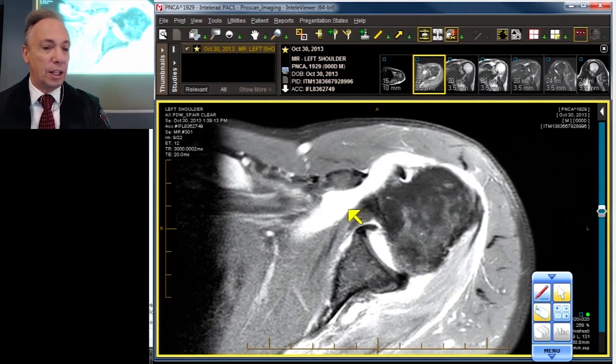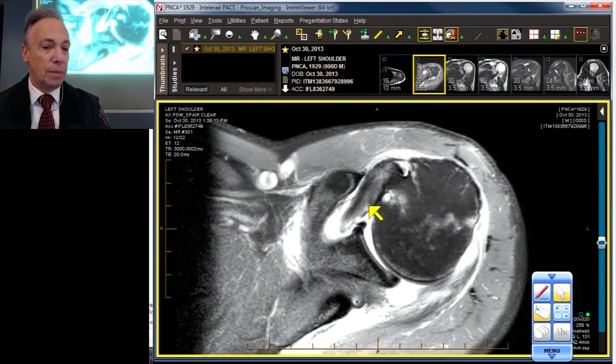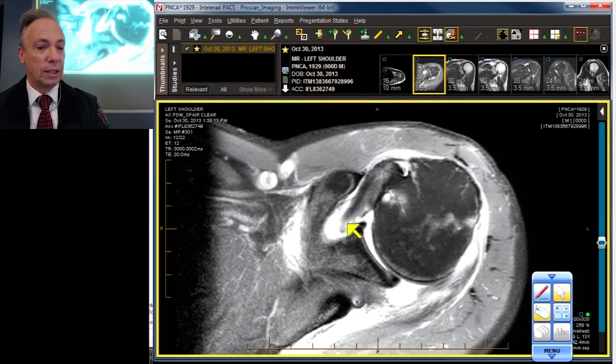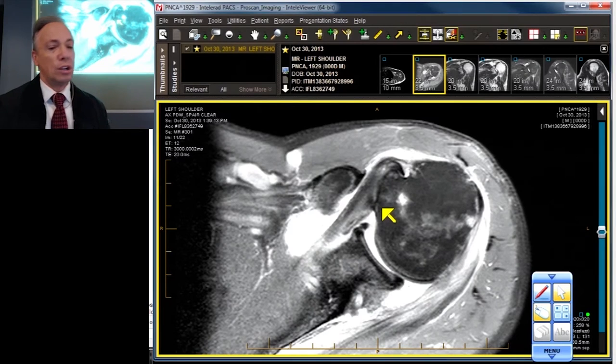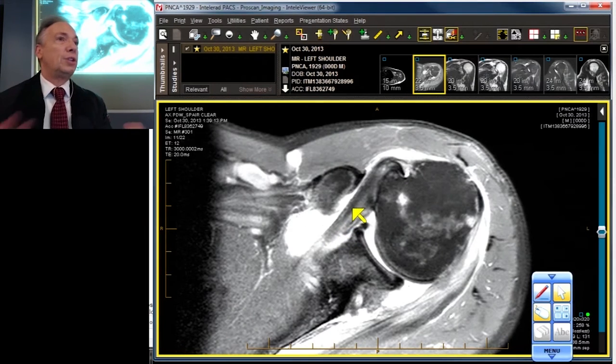Let's pay attention to the subscapularis as we move on down. We are missing the subscapularis fibers right here — at least the deep ones. The superficial ones are intact but the deeper ones are torn. And with those fibers runs the middle glenohumeral ligament, which attaches right there and is intact. So the deep fibers of the subscapularis are injured, but the superficial fibers are intact — at least we've got some of the cuff still present.